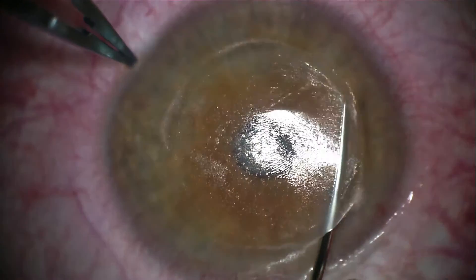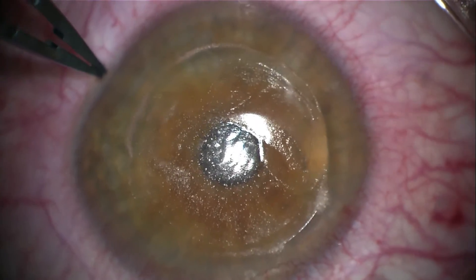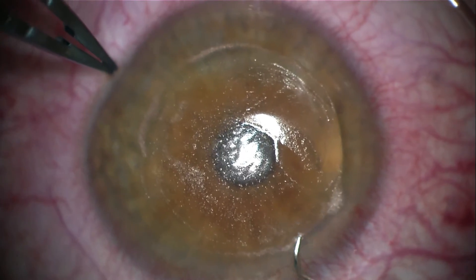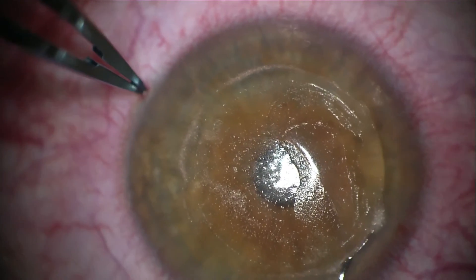As you can see here, I bring the lenticule to one side of the pocket and then go under it with the Szynski hook. Then I hitch onto the lenticule and I bring it out, and now I can easily grasp it with the forceps.